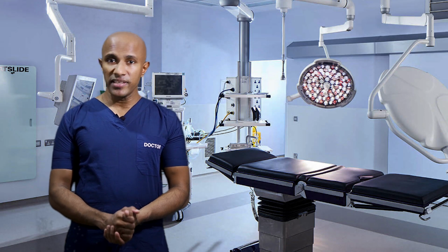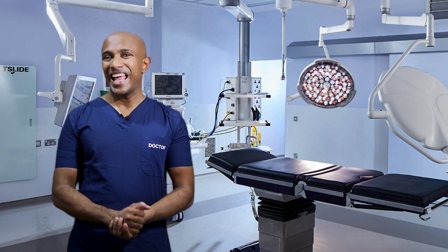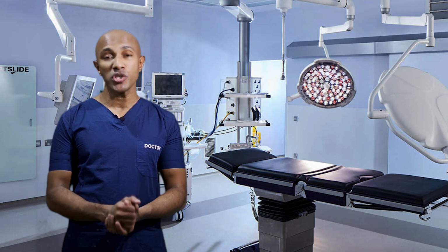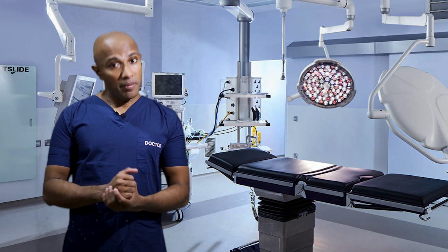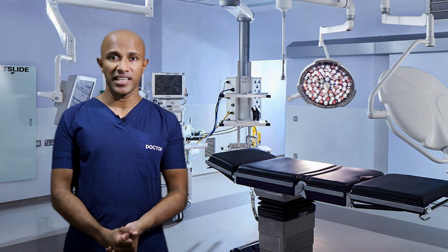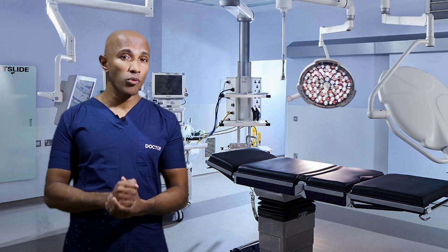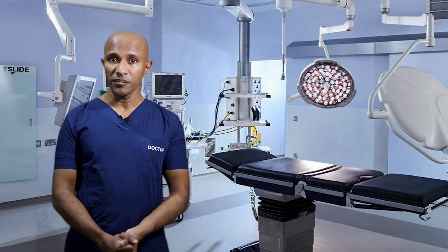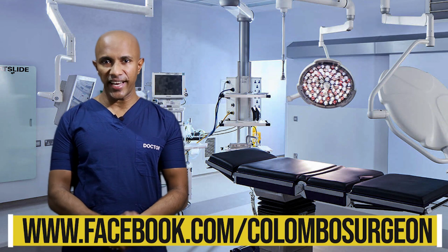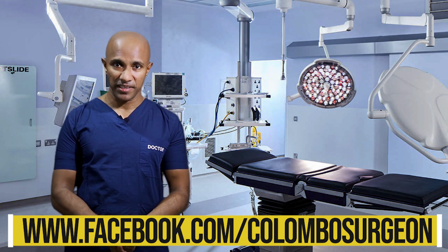Very few centers worldwide have these robots. In most countries, any theater in a hospital that has a surgeon is able to do most open surgeries. Most hospitals are also capable of performing laparoscopic surgeries, but very few centers are capable of performing robotic surgery. This low availability also affects training, and not every surgeon is trained in robotic surgery.